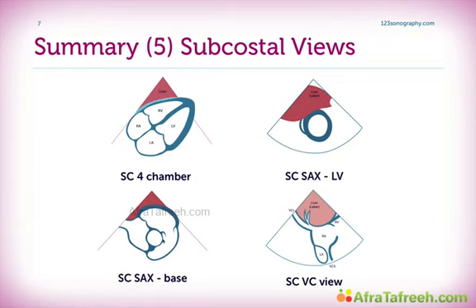Short axis views can be performed from a subcostal approach, just the same as for a peristernal approach. Again, a very similar view than we've seen before. The short axis view at the base with the aorta in the center. We have short axis views of the left ventricle, and we can perform a view which allows us to see the vena cava inferior as it enters the right atrium. This view is particularly helpful for the assessment of right atrial pressure and other pathologies which involve the inferior vena cava.